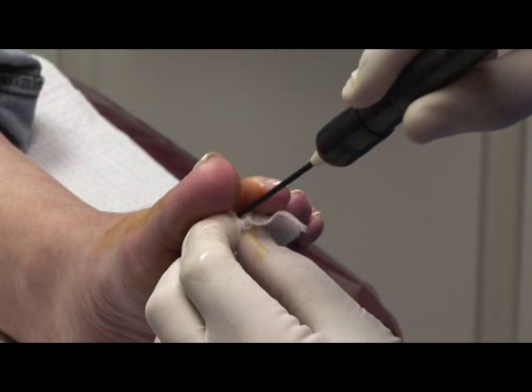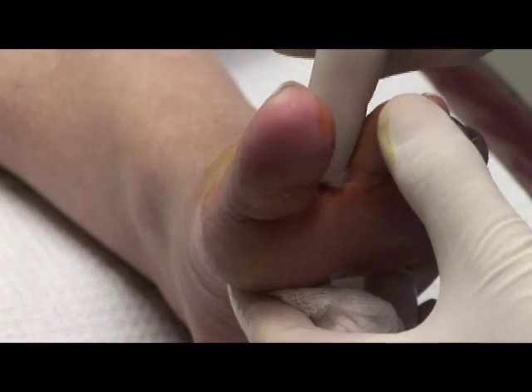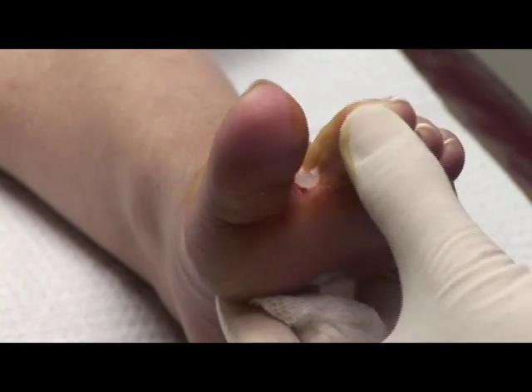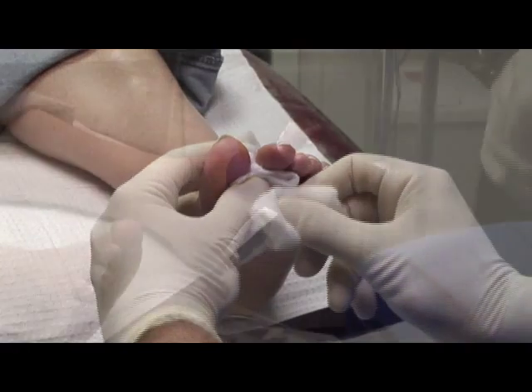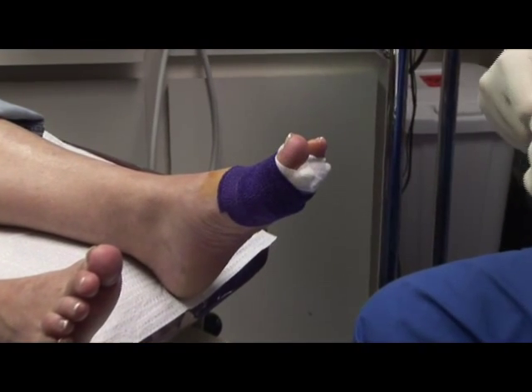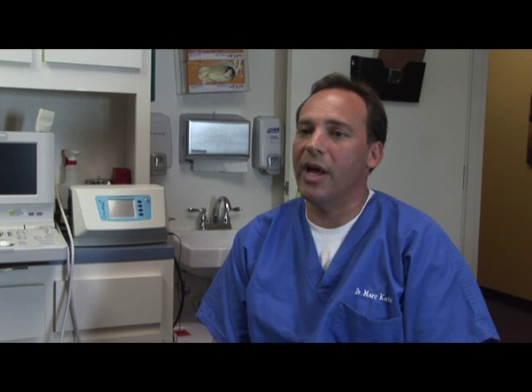So after the second freeze and the 30-second break, we'll then be done with the procedure, and we will gently take the cryoprobe out. Following that, we'll place the bandage on with the antibiotic cream, and the patient will be instructed to keep that on for 24 hours. The patient can do basic activities such as walking around the house and doing work around the house. No excessive walking, no sports, or any type of working out, and that's for 48 hours.